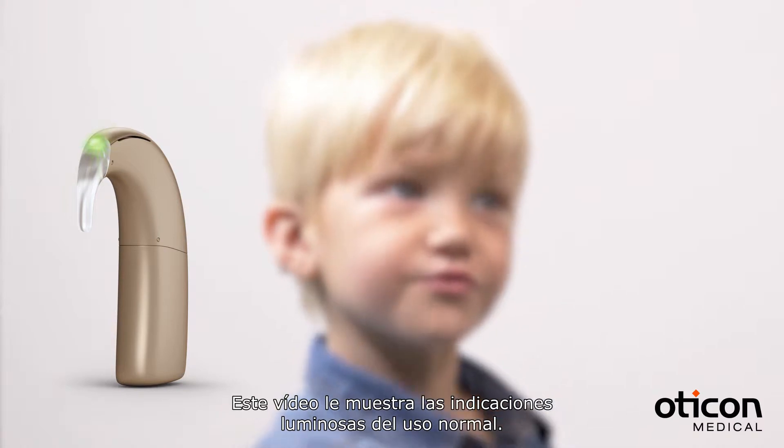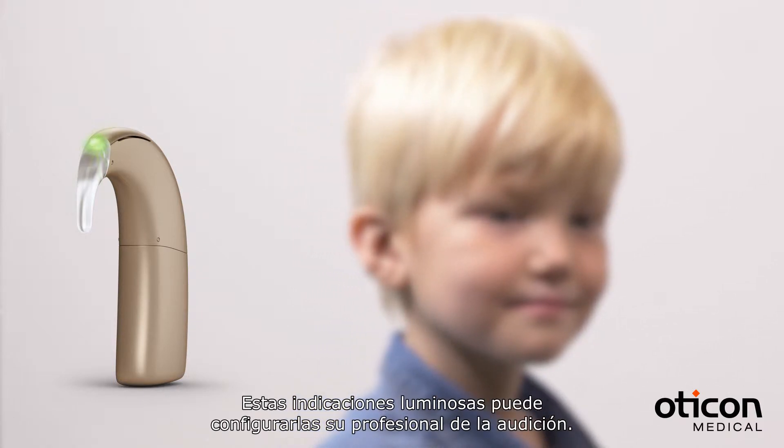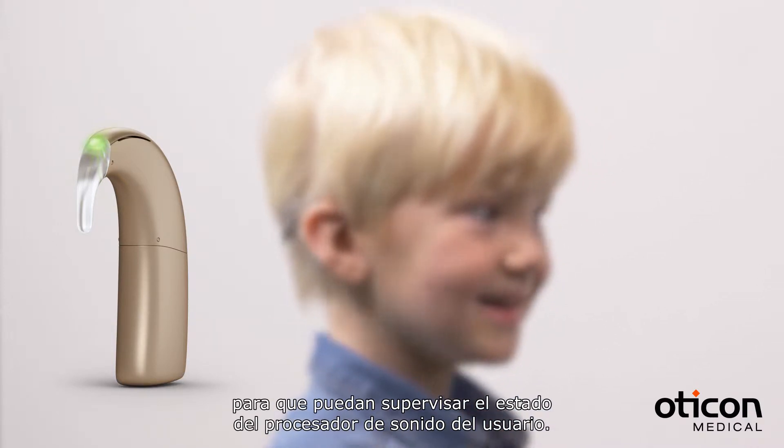This video shows you the light indications for normal wear. These light indications can be configured by your hearing care professional. They are particularly useful for caregivers so they can monitor the state of the user's sound processor.